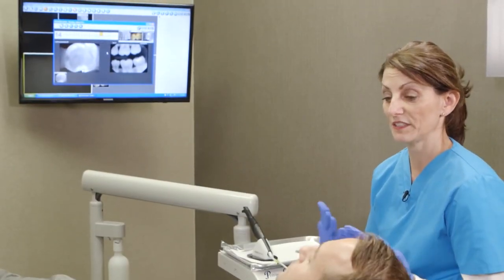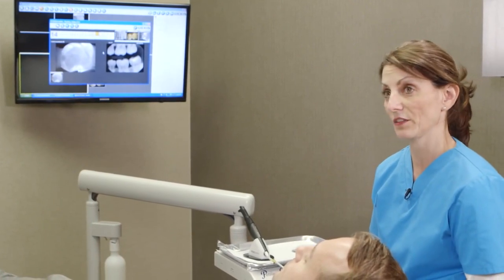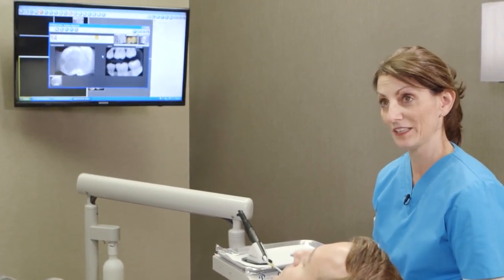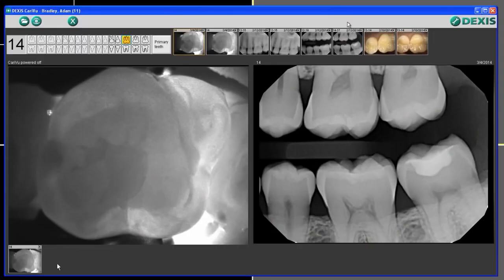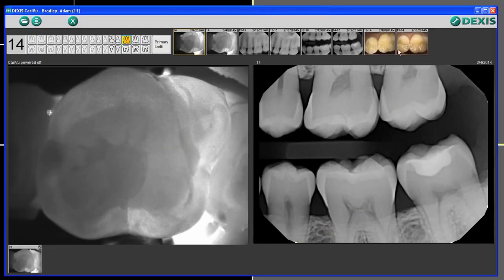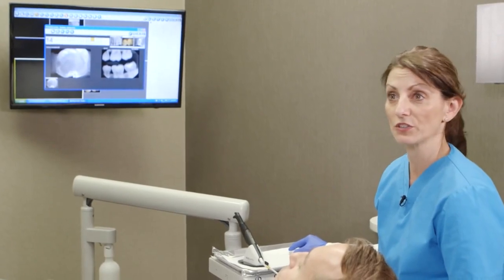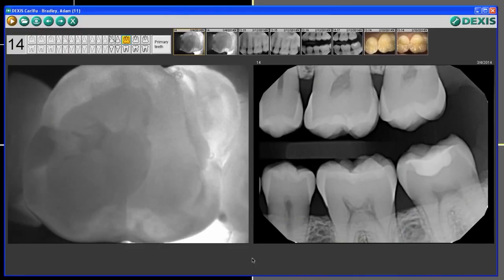One thing I love is being able to educate my patient on what I'm seeing so that they understand the point of view we're coming from when we're diagnosing something in the mouth. What I love about DEXIS and CariVu is it automatically brings up an X-ray, a photo, or previous CariVu images for the specified tooth number. We can see if there's been any change since the patient was here last — it's a great way to show them on screen exactly where there could be caries.